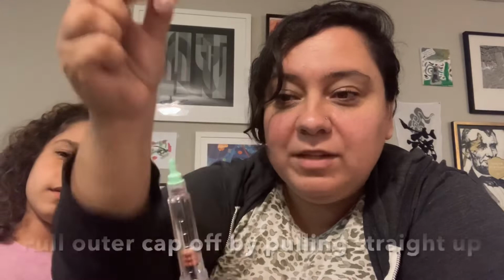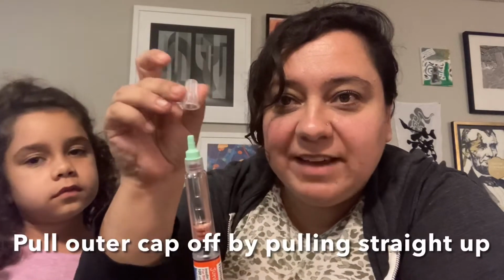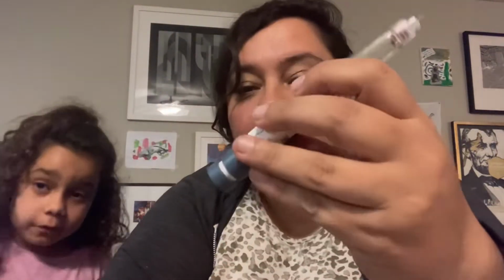Then you're going to pull this cap off. This is the protective cap that you're going to need to dispose of the needle. So you're going to put this to the side. Then you're going to take off the inner green cap. And you can see here is the tiny little needle. And just remember, grown-ups and kids, safety warning. These needles are really sharp. Be careful.